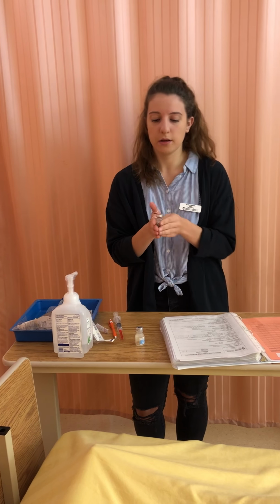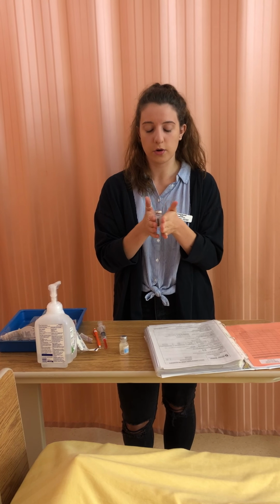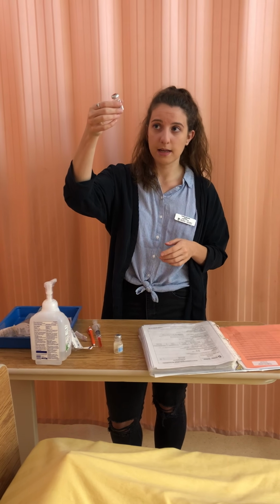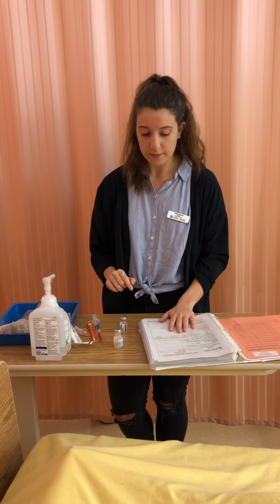So now I'm going to gently roll my vial here to mix the medication. I'm doing this gently so that no bubbles form. Some things just to watch out for with this medication. I'm looking for any sedimentation. There isn't any. It is fully dissolved, so I can now draw out my medication.